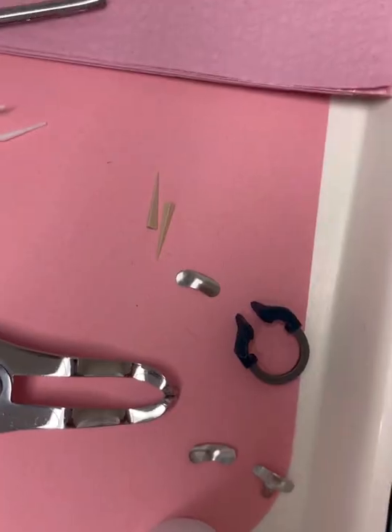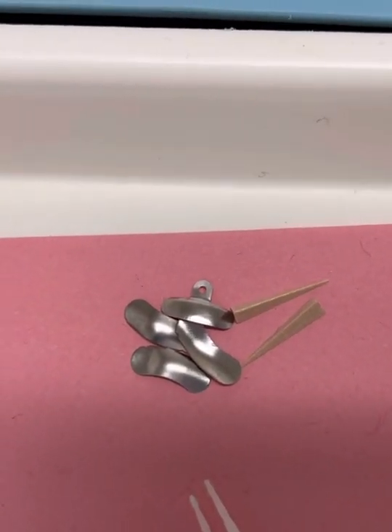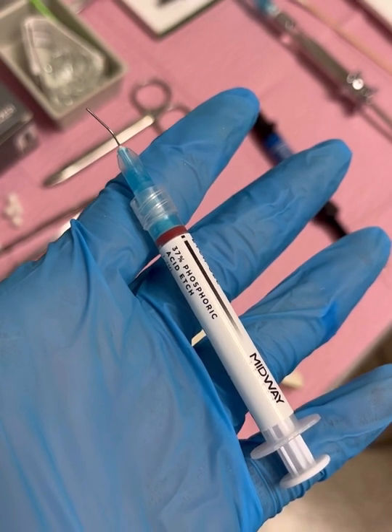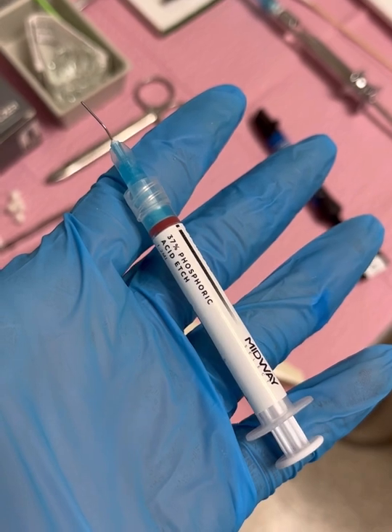You will then place matrix retainer wedge if needed. Then rinse and dry the prep and transfer the etch to the operator. Once the operator begins etching, the process start time. You will etch for 30 seconds and rinse 30 seconds.